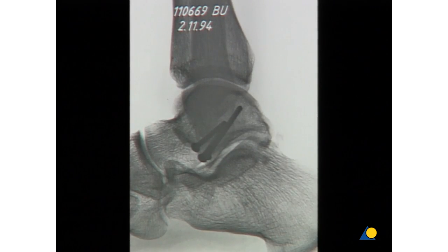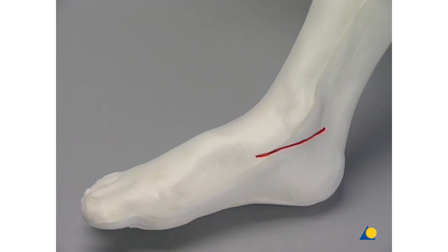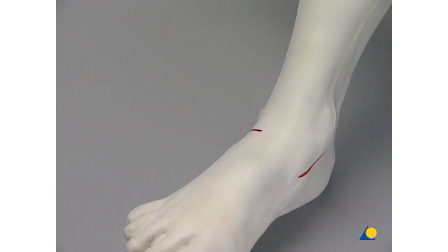70% of the surface of the talus is covered by cartilage. We will perform our exercise through the anteromedial and the anterolateral approaches.